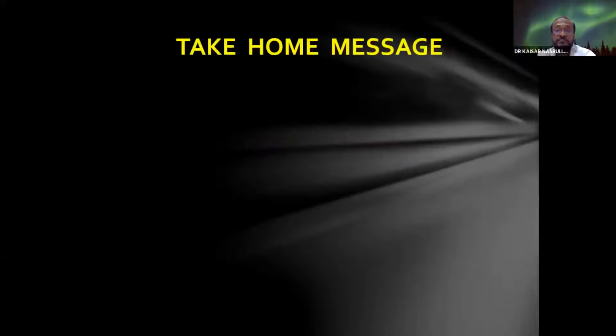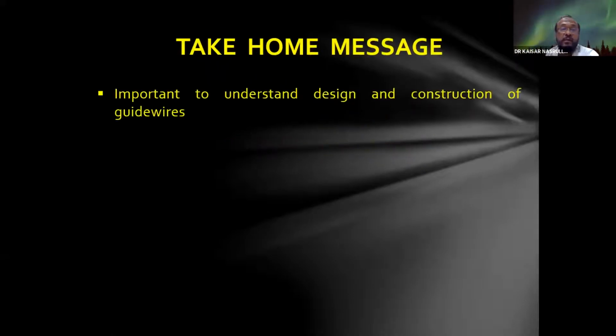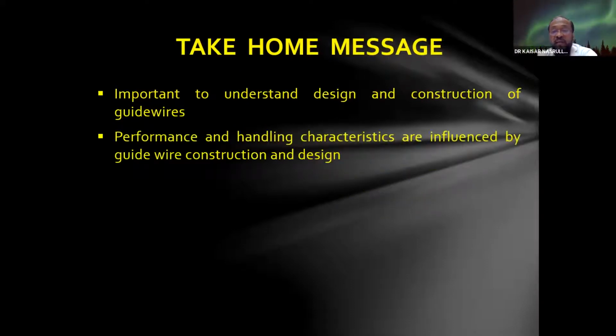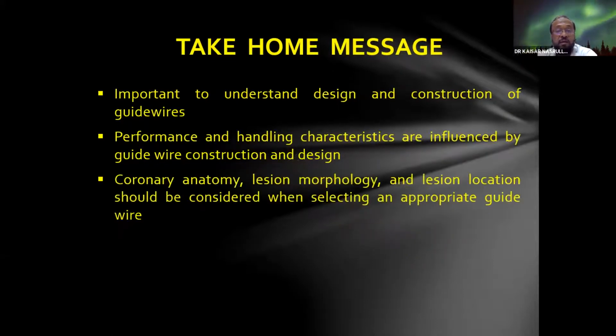So, take-home message. It's important to understand the design and construction of guide wires. Performance and handling characteristics are influenced by guide wire construction and design. Coronary anatomy, lesion morphology, and lesion location should be considered when selecting an appropriate guide wire.